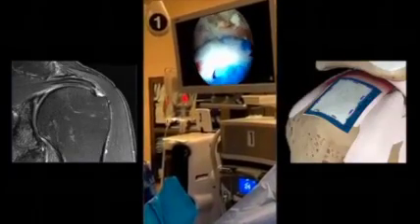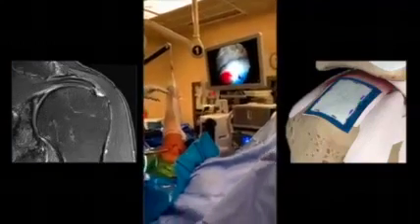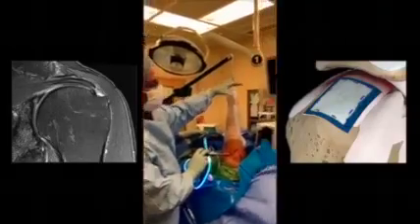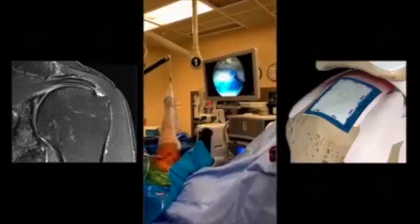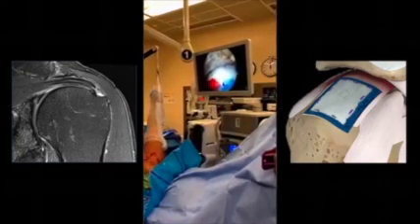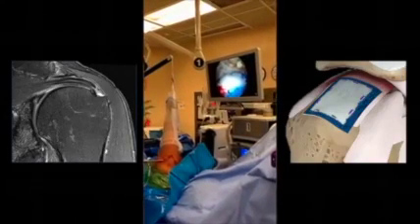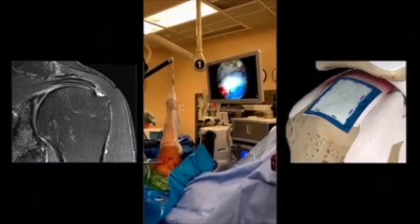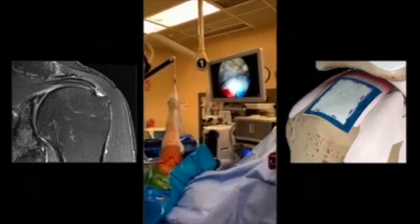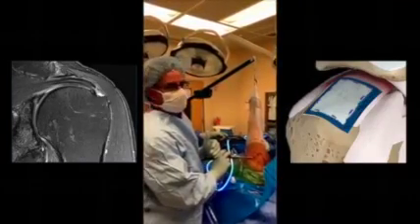So this is a collagen-based implant that basically comes from the Achilles tendon of a cow. It gets purified, and then it gets placed into this type of a scaffold. And within 12 to 14 days, this is already cooking. We're already getting incorporation of this implant into the tendon itself. And then over time, if you come back in and take a second look at 3 months, 6 months, and 12 months, the patch goes away and it gets incorporated into the tendon. So it's really amazing biologic healing that's happening here, and we're seeing really terrific results.